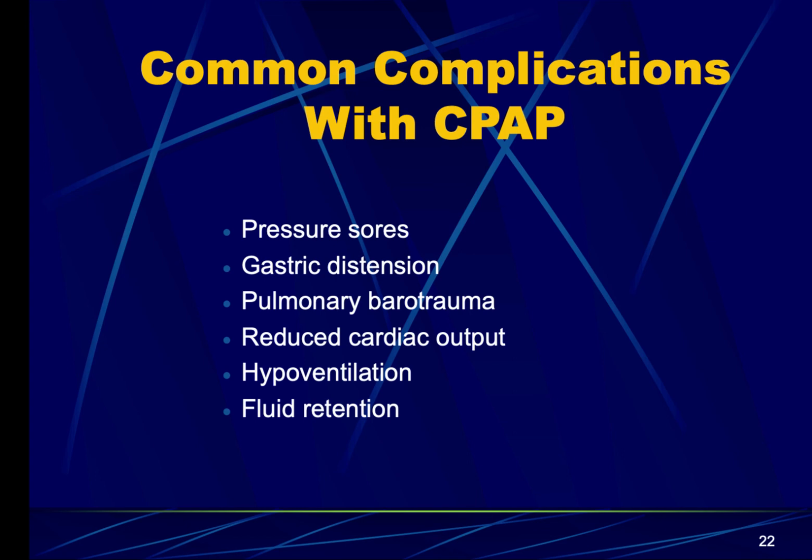And once we get her going on that, we've coached her breathing a little bit, given her some warnings of the expectations of what the machine might feel like. She starts breathing at a normal rate again. Her respiratory rate might come down a little bit, and she's sitting, let's say, at high 80s at this point. So you guys decide to increase the PEEP, and let's say you move it up another 2.5, so you're at 7.5, and your sats are good, but your blood pressure is dropping, right?